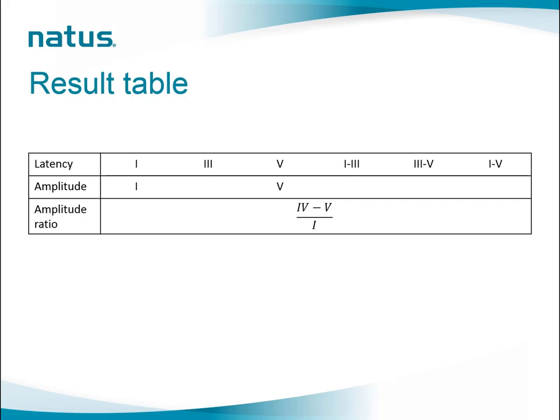We shall also mark the amplitude of the waveform of wave number 1 and 5 and calculate the amplitude ratio between peak 5 and 1. So those are the guidelines.